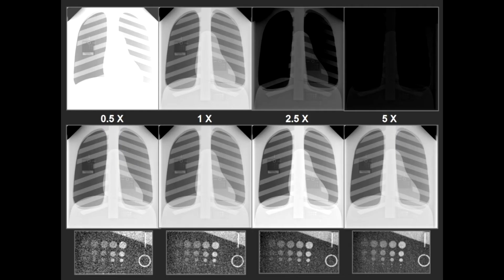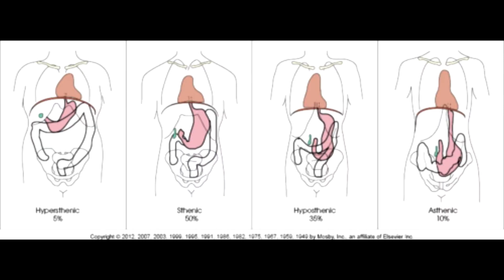I would also like to mention, radiographically speaking, density can also be referred to as how dark an image appears. Next, we have patient size.